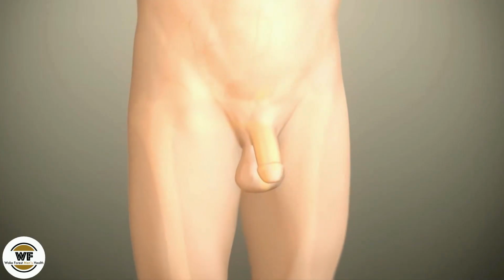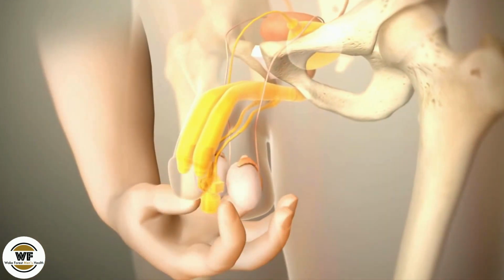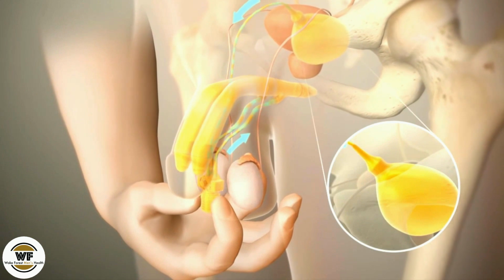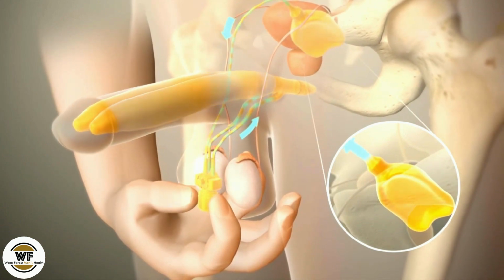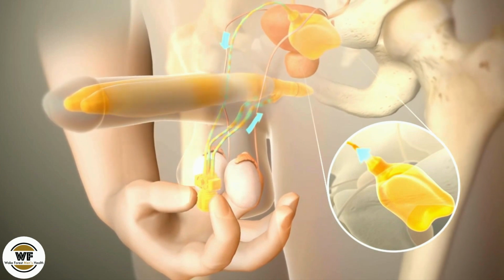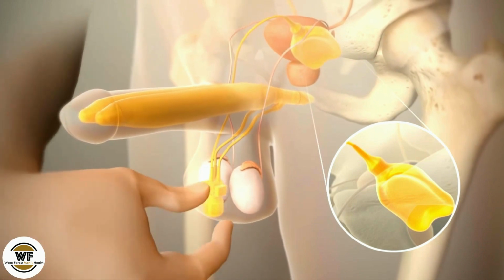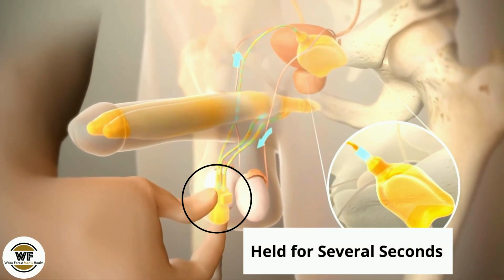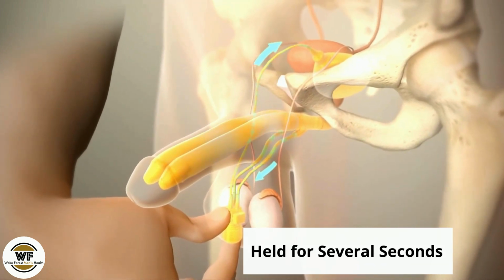In this cartoon animation, we see the individual components. Upon pressing the bottom of the pump, the fluid enters the chambers to create an erection. To empty the chambers, the deflation button is pressed and held for several seconds. The fluid now leaves the cylinders and goes back to the reservoir.